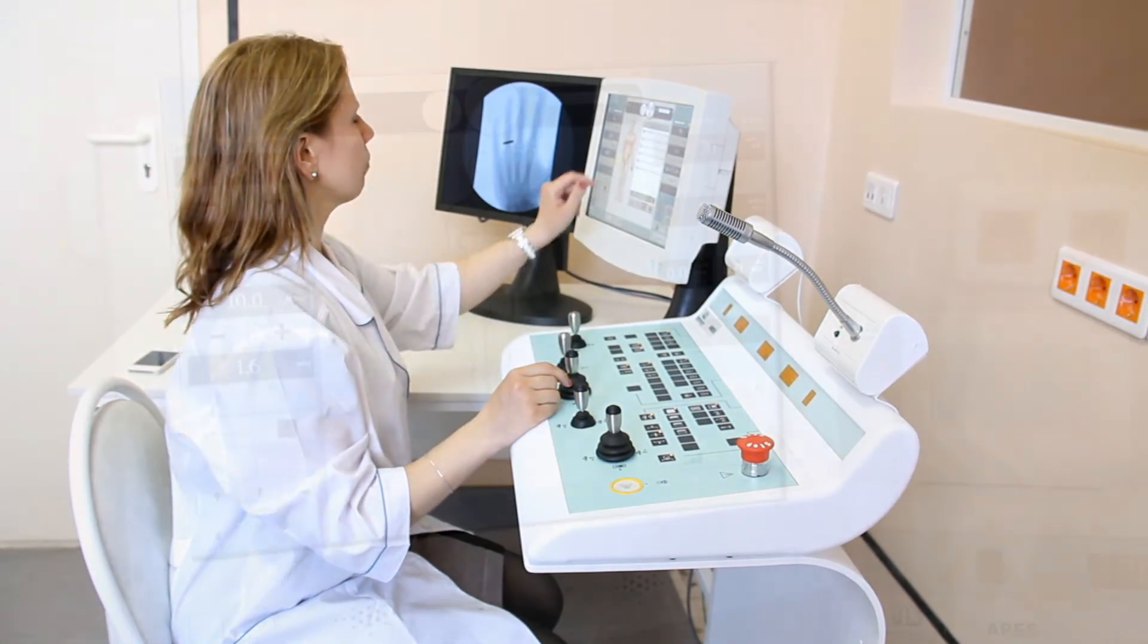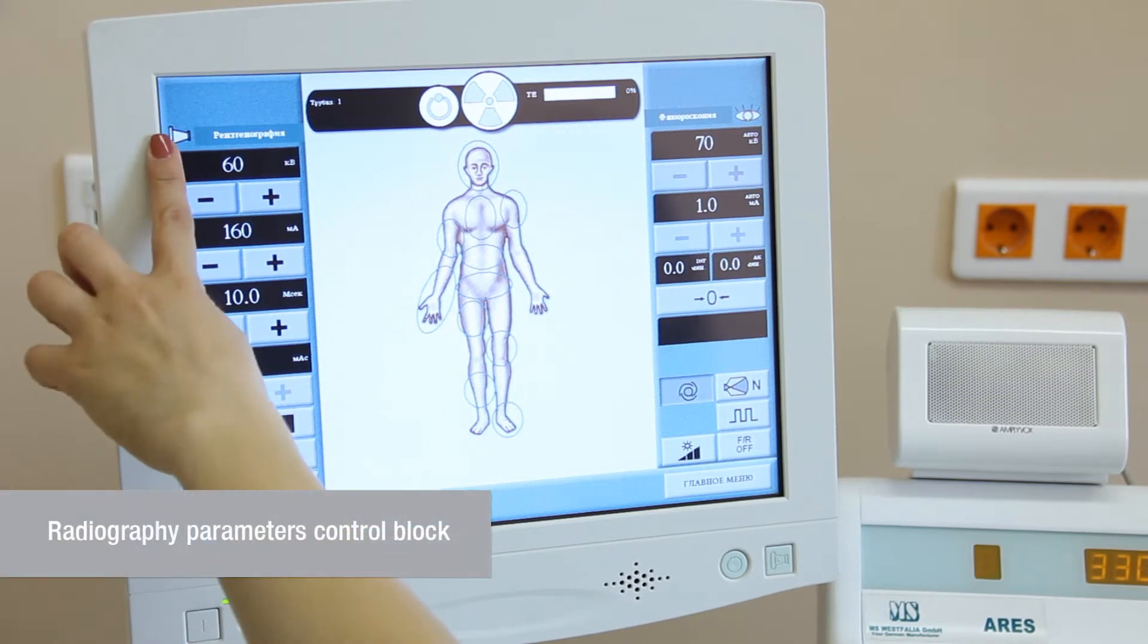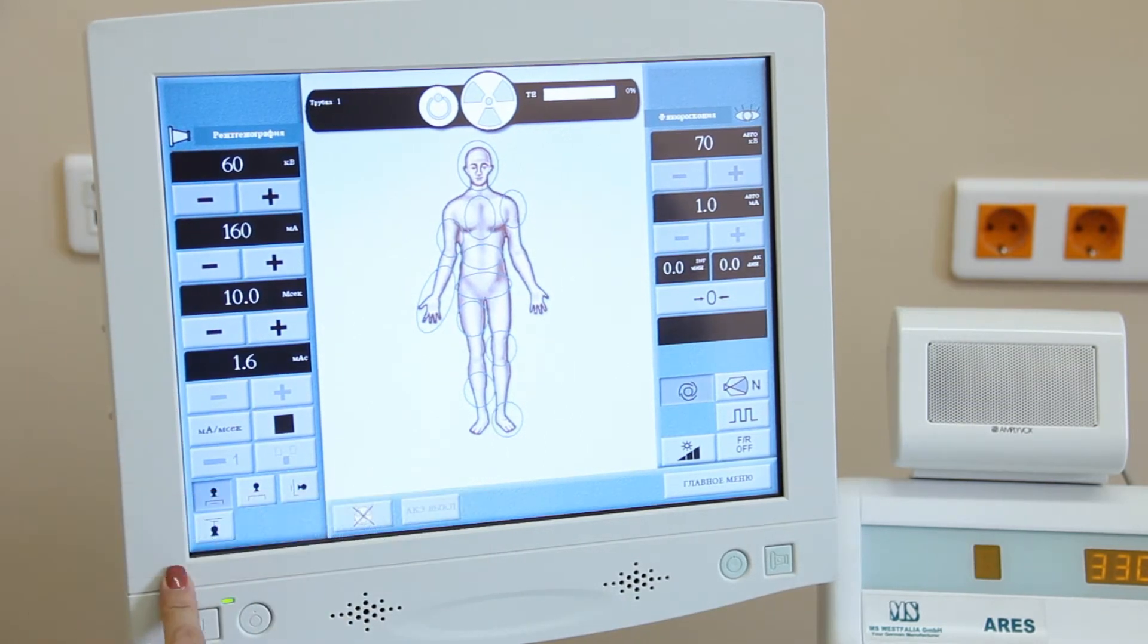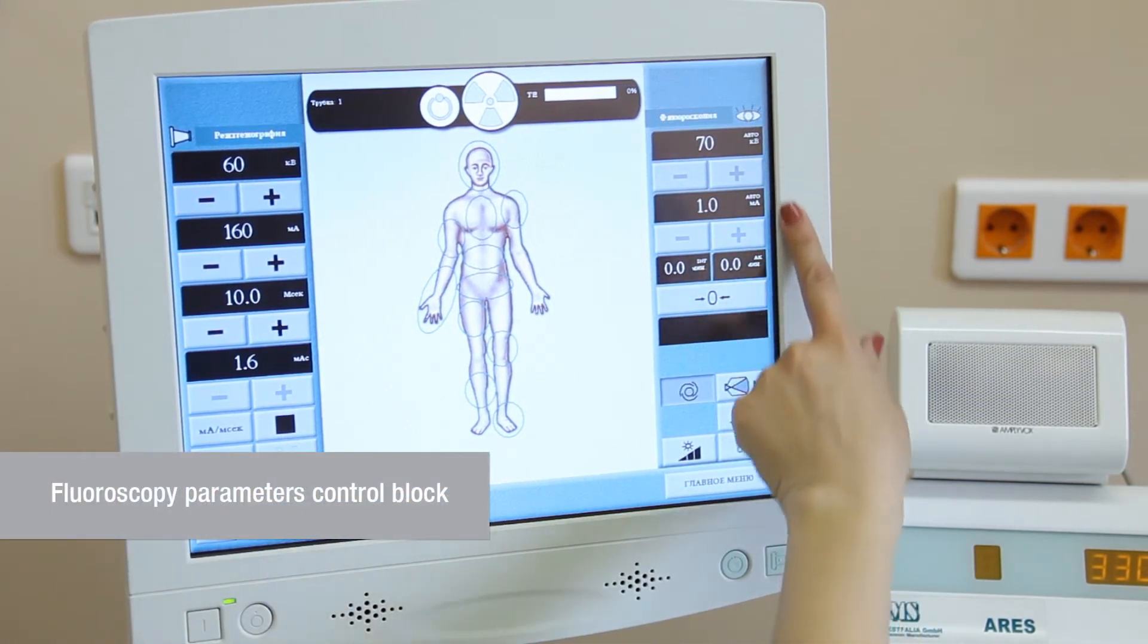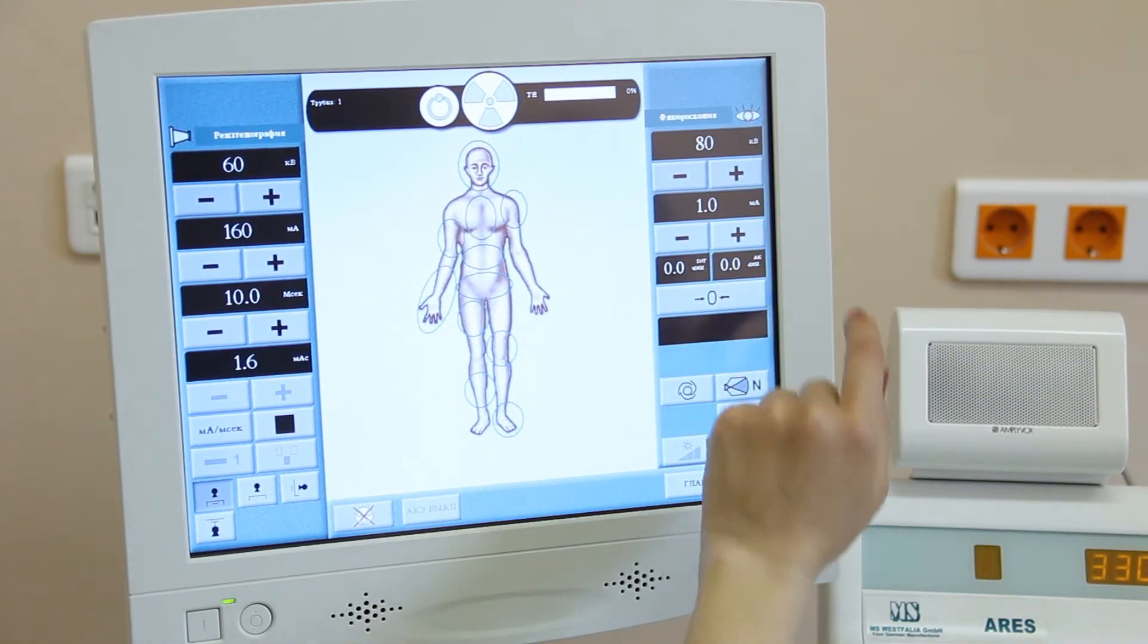Control block of radiography parameters is located on the left side. Control block for radioscopy is on the right side. Parameters for radioscopy may also be adjusted manually.